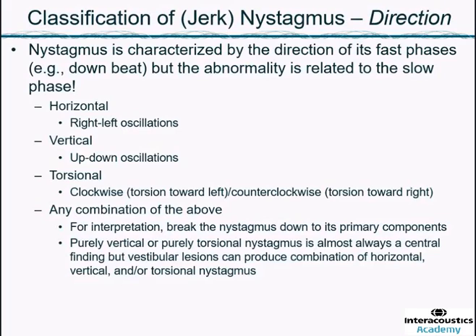I prefer to use the terms torsion toward the left or torsion toward the right. The reason for that is that whenever we talk about the direction of nystagmus, we talk about the direction with respect to the patient. So it's the patient's right or patient's left. And that's consistent throughout the vestibular evaluation.